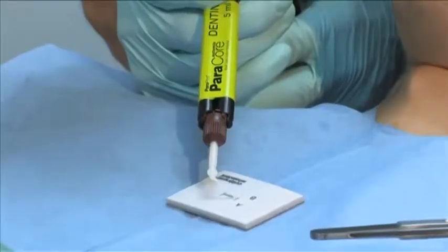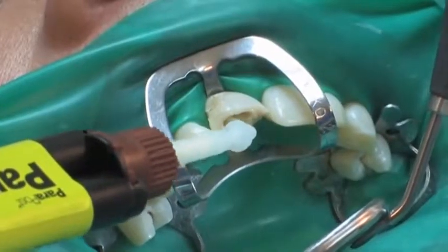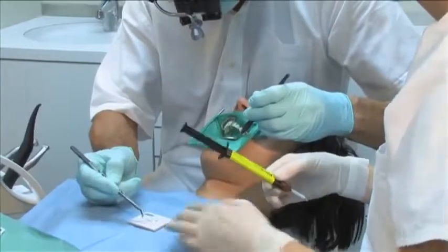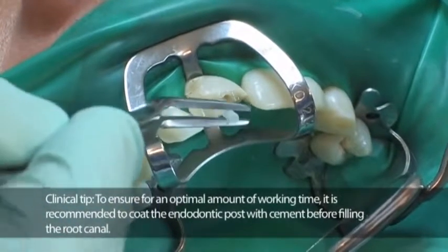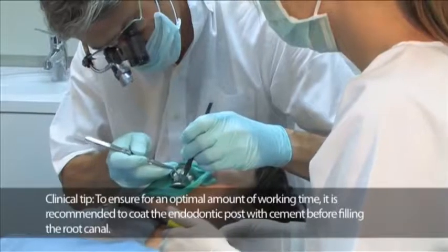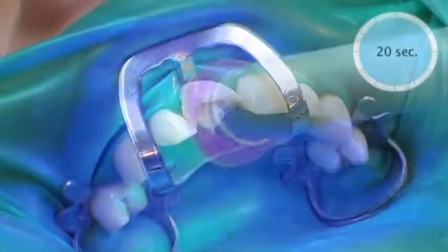The convenient curved root canal mixing tip allows ParaCore to be applied directly into the root canal. The untreated post is coated with ParaCore and cemented into the root canal. Since ParaCore is dual cured, the curing light can be transmitted through the glass fibre post, reaching the ParaCore material in the apex to accelerate the curing process.